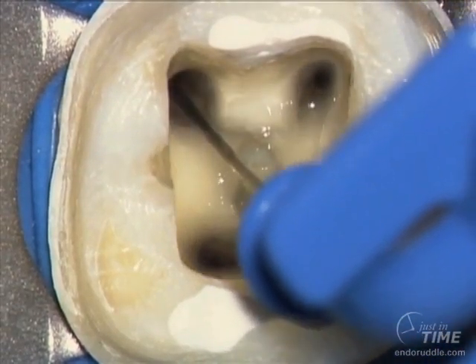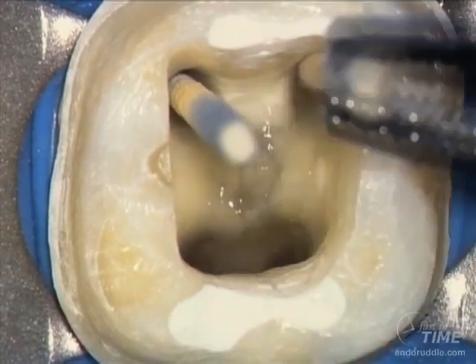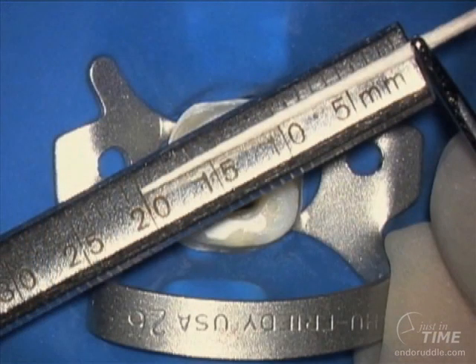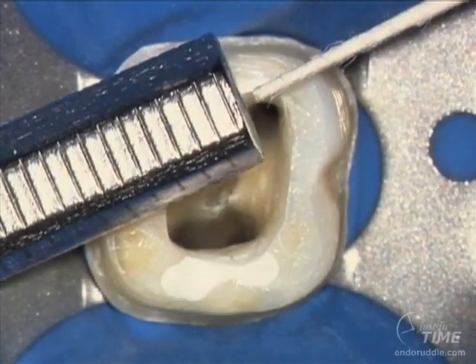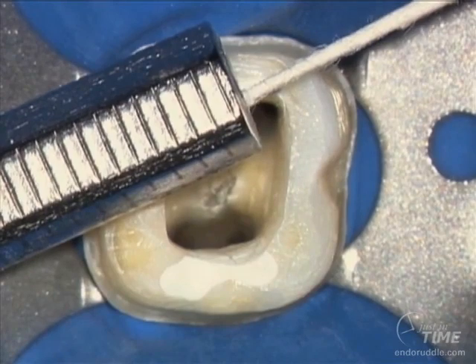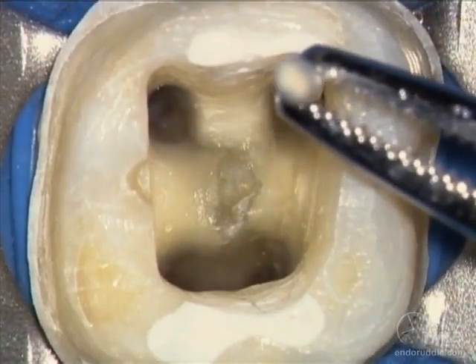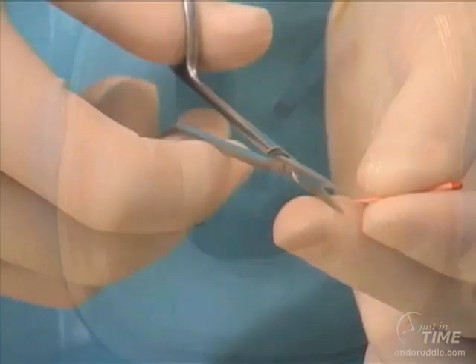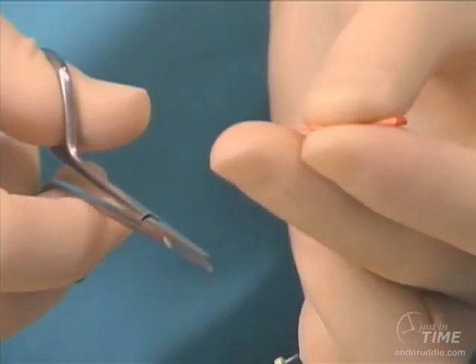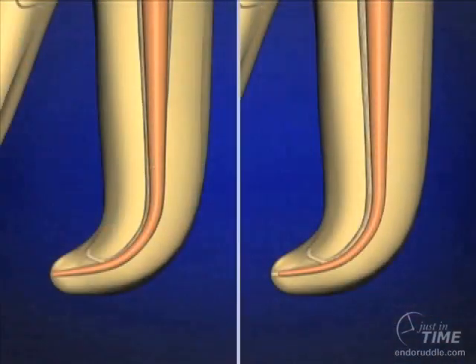Aspirate and suction out your reagent — most of it can be eliminated with aspiration. This reduces the number of paper points required to wick up residual moisture. Set your paper points a little longer than your master cone to see if the canal will dry a little bit deeper. The part of the paper point that is dry is the part inside the canal; the spotted part is beyond. So the cone needs to be trimmed back to the consistent drying point determined with the paper point drying method.